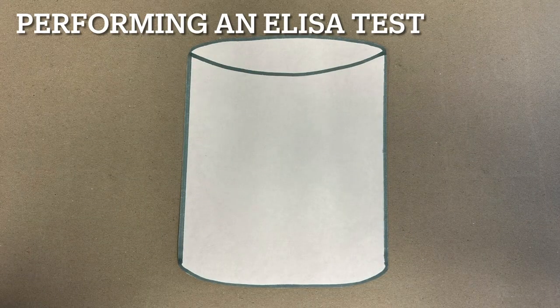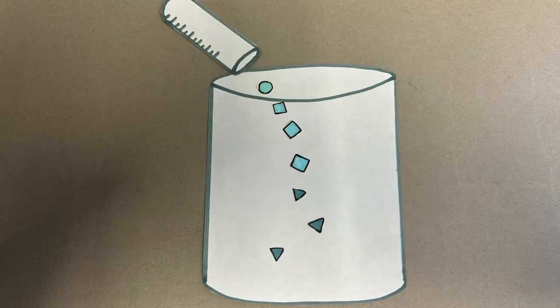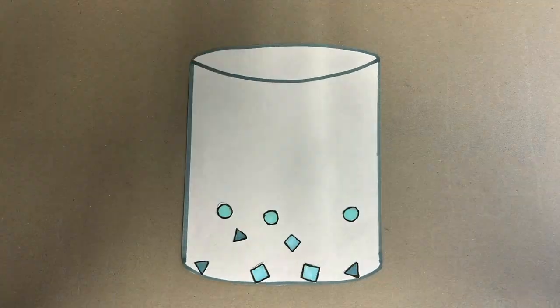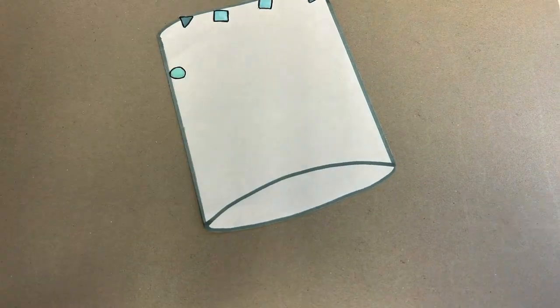The first step of the ELISA test is that the sample being tested is added to the wells. The proteins in the sample then bind to the walls of the wells. Any unbound proteins are then washed out by a detergent.